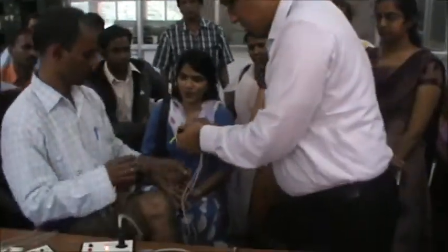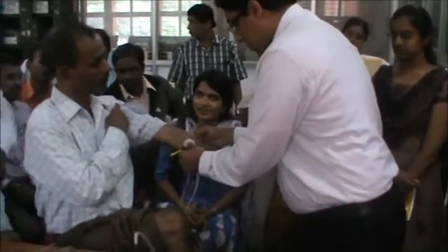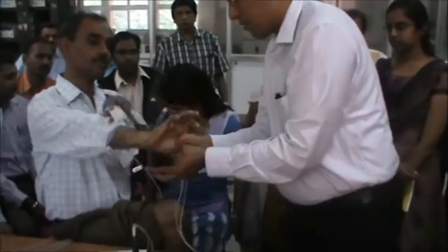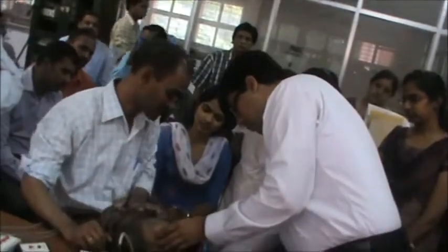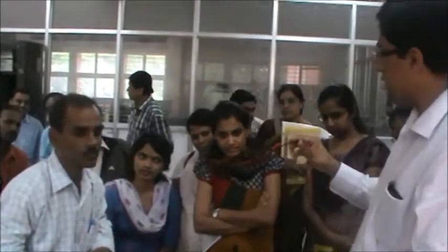Right arm, left arm, and your right. So now we are acquiring the ECG. So I am taking the output and monitoring it on the oscilloscope.